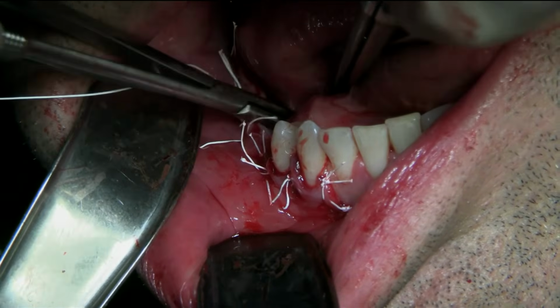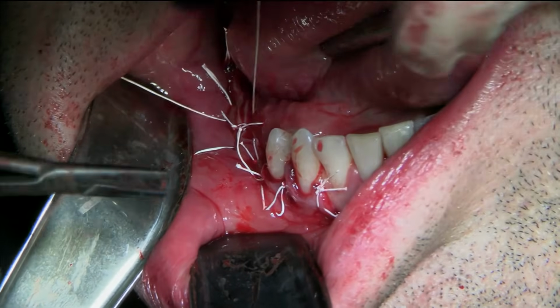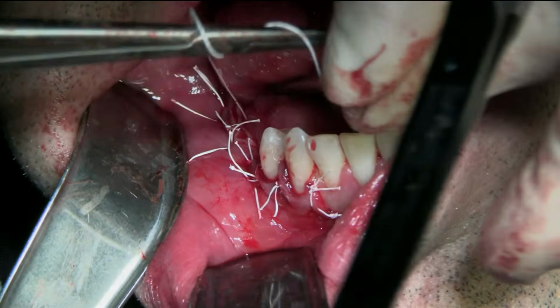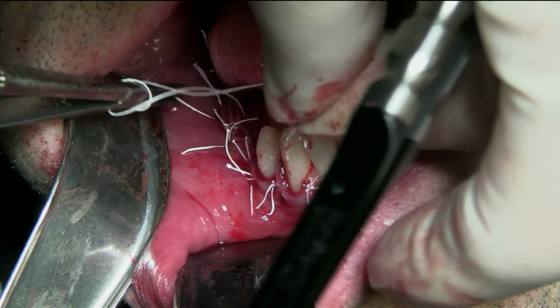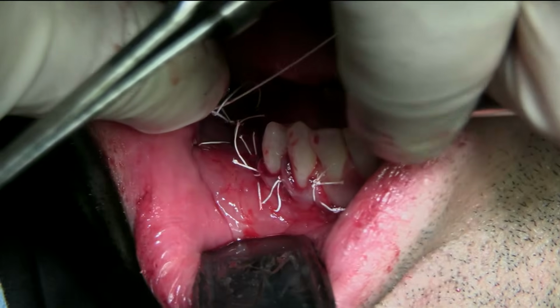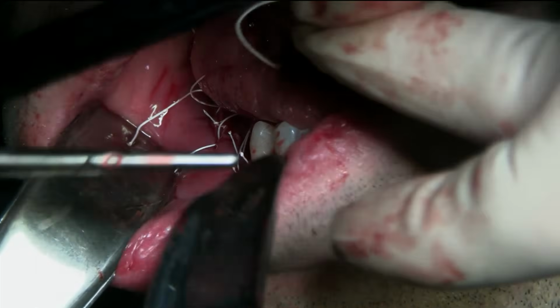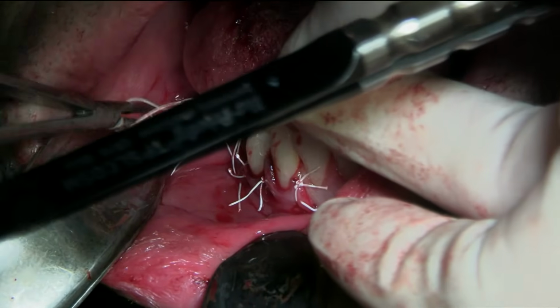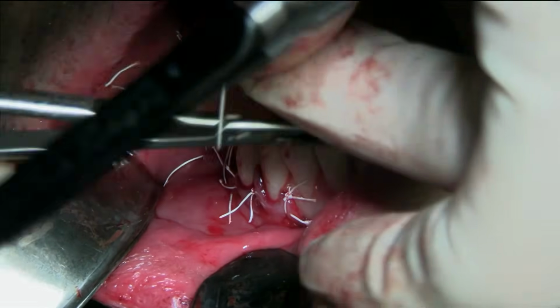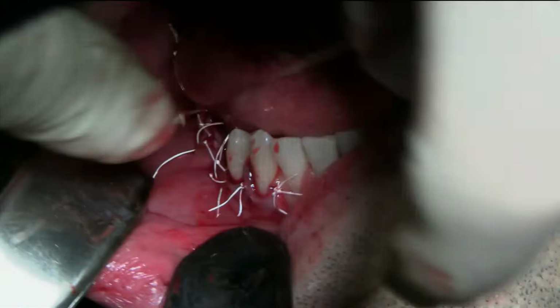Late is similar. The only advantage of the late one is that I prefer late exposures over early because the bone is already more mineralized and has more vital bone than when you have an early exposure. When you have a late exposure, you're going to have less bone resorption. With an early one, you're going to get a little bit more of your graft shrinking. So late is more beneficial than early.